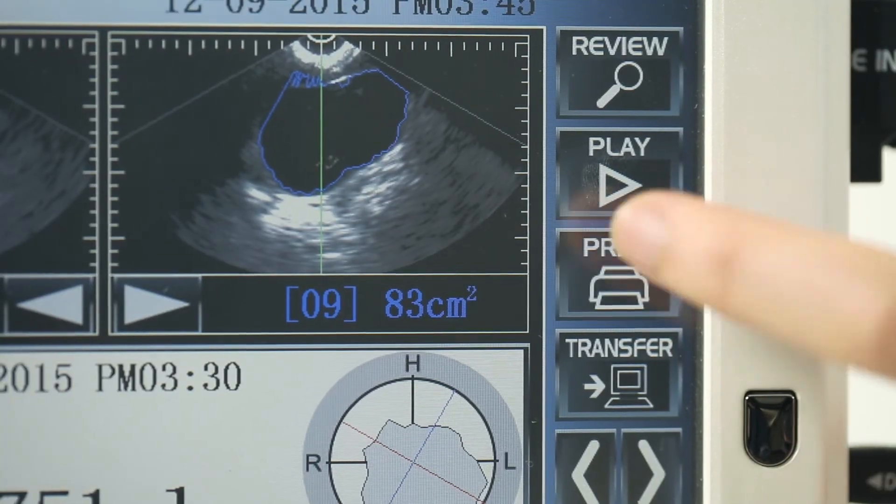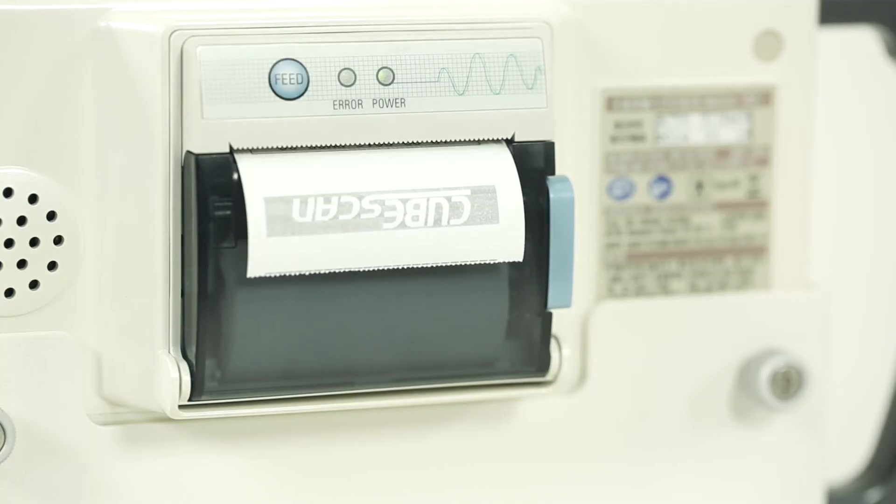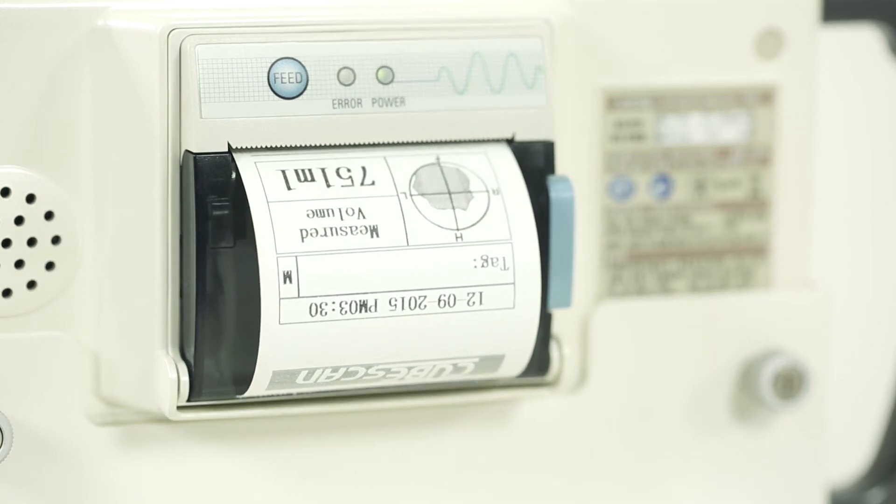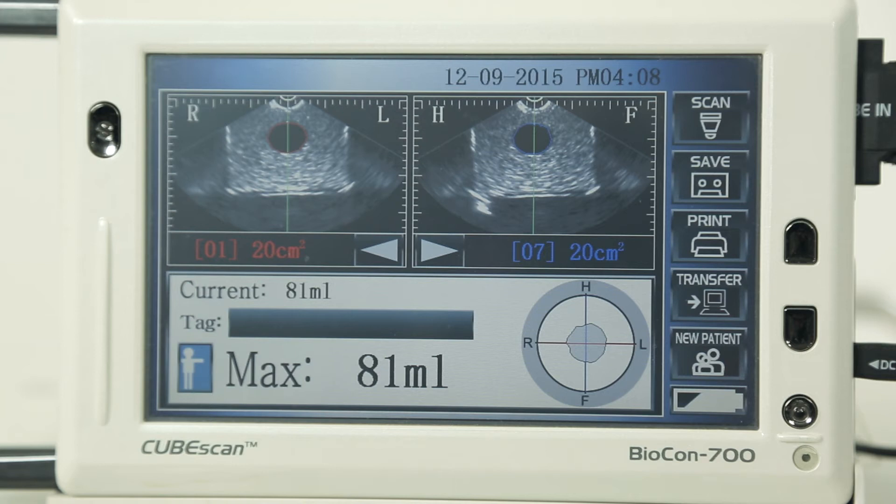Press the print button and confirm the exam results from the onboard printer located at the back of the device. If the scan is on target, the bladder will be shown in the center of the crosshairs on the screen.